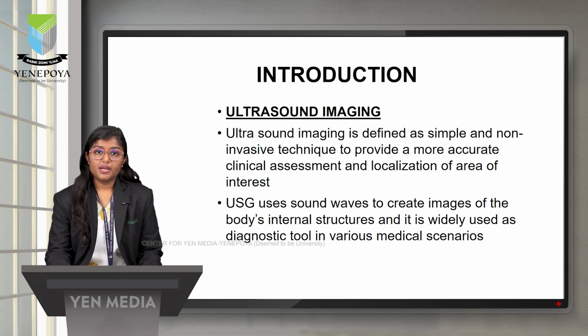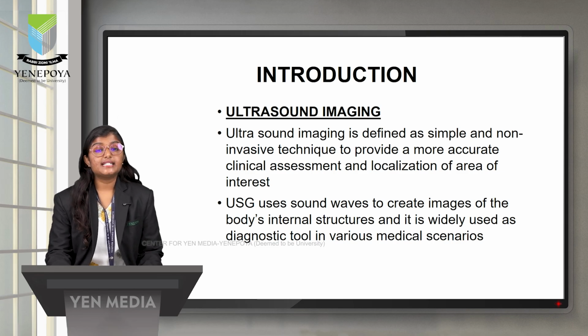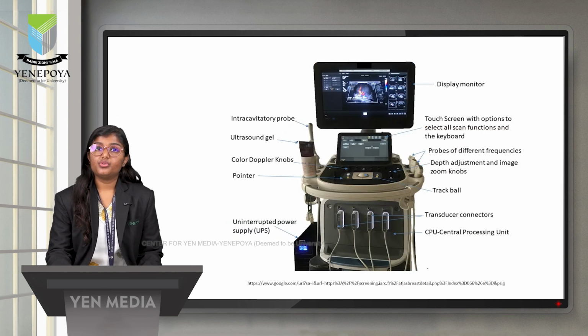This USG uses sound waves to create an image of the body's internal structures, and it is widely used as a diagnostic tool in various medical scenarios. So this is the image of the USG machine.